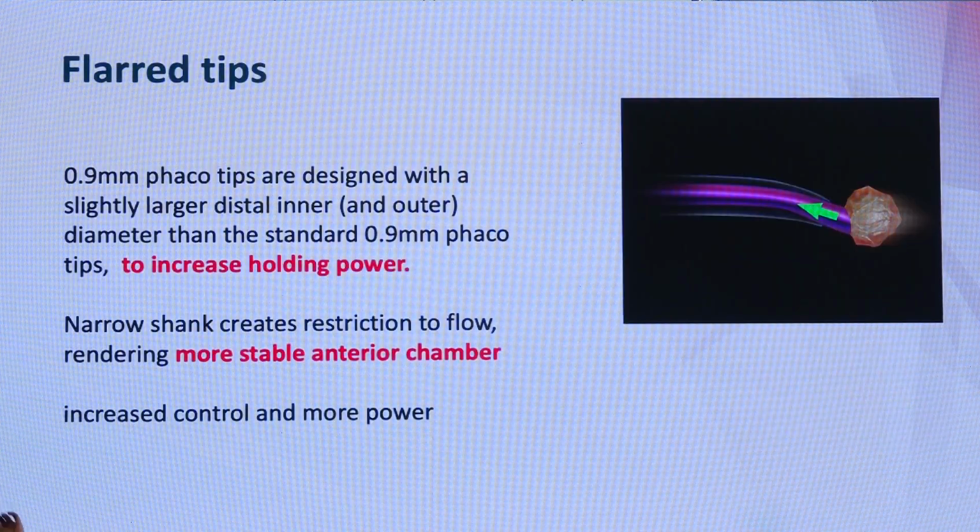Then also came the flare tips. It's the same kind of tip but a little flared at the edge. So it gives a better holding and more stability of the anterior chamber.